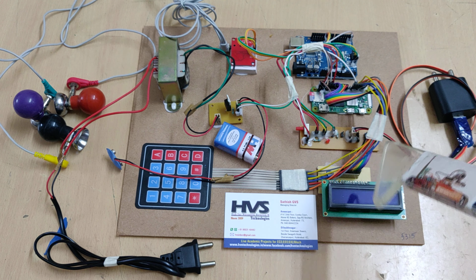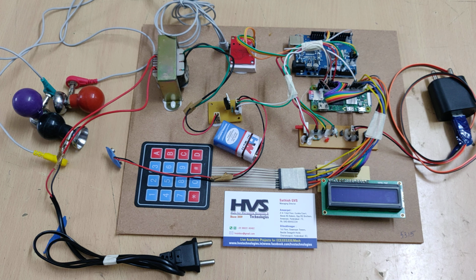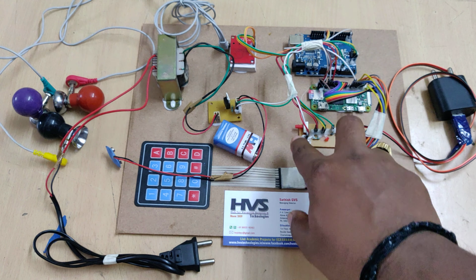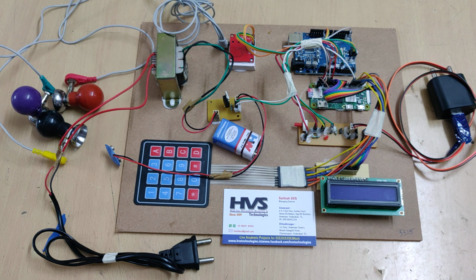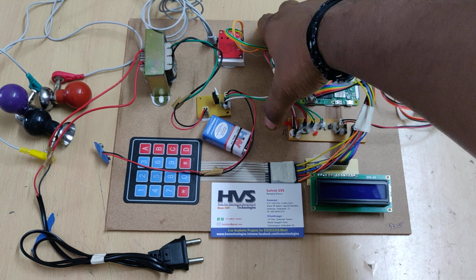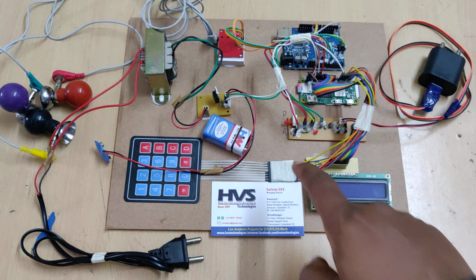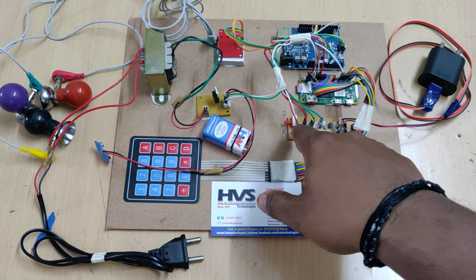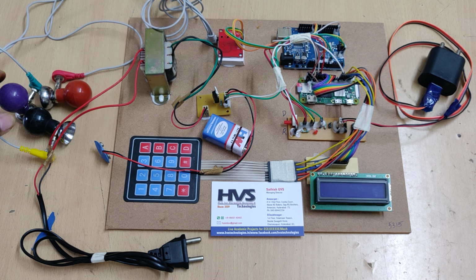The code steps consist of reading the data from the serial port, and also we can select the dataset mode or the real-time mode directly. By switching this selection, above is the dataset mode and below is the real-time mode. Coming to the real-time mode, when we place it in real-time mode, the real-time data will be captured from the ECG sensor. So we should place these electrodes on our body.